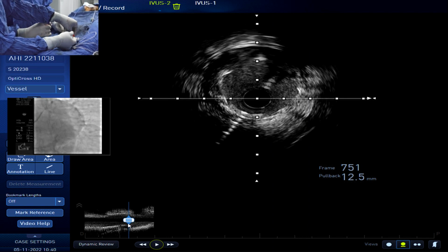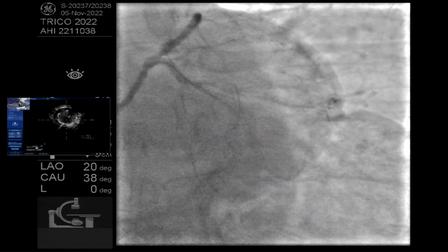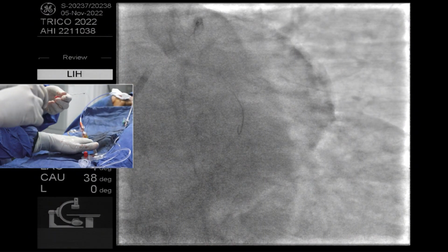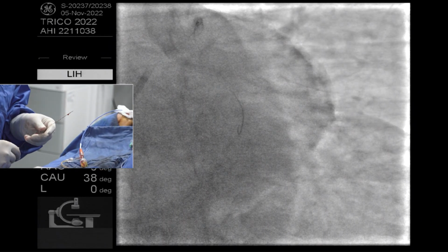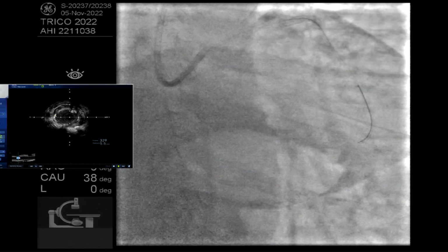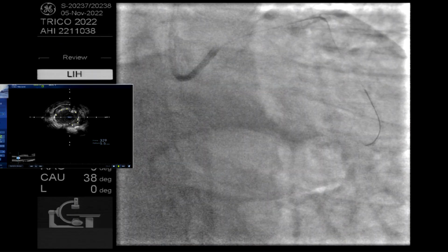So Dr. Saito put 3 millimeter, this 12 one? Yes. I have to make a strong bend. Okay. Yeah, wait a moment. Dr. Akasaka, can you show us the ostium of the LAD. OM? Yes, OM. That is what we have stented just now, with the proximal part of the stent, beyond the proximal part of the stent. Okay, wait a moment.